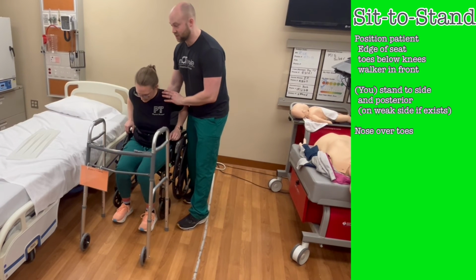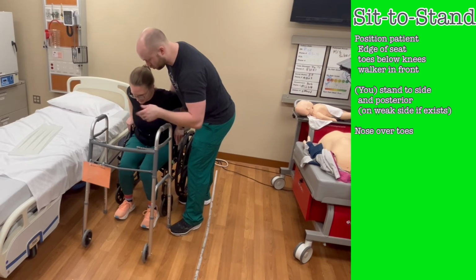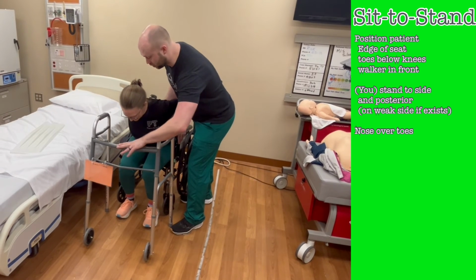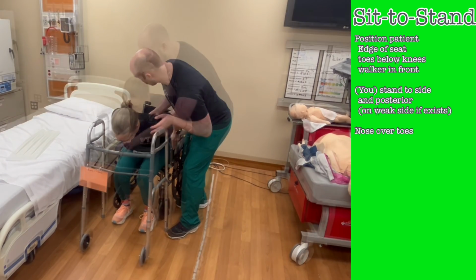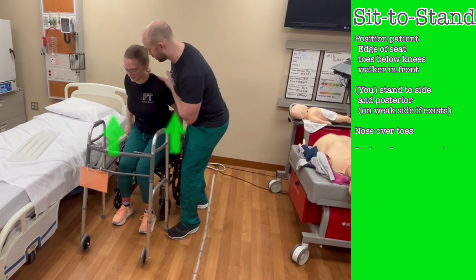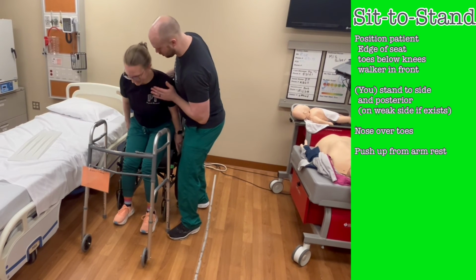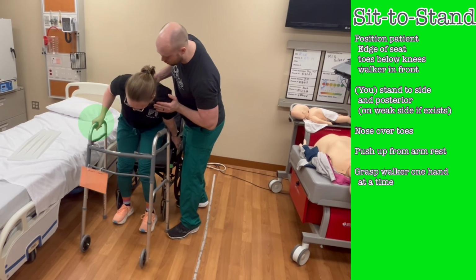Instruct the patient to bend over to get their nose over their toes. They need to lean over a lot, probably more than the patient realizes, so encourage and cue them to bend over fully. Nose forward, forward, forward, lean forward. Then push up from the armrest to stand. When standing and still leaning forward, grab the walker with one hand and then the other.